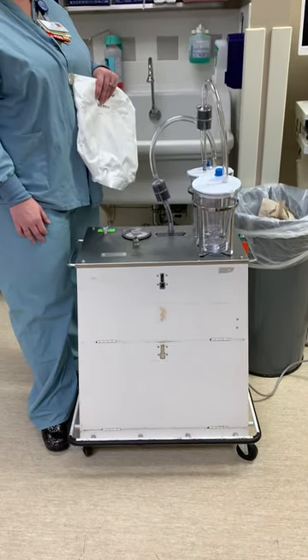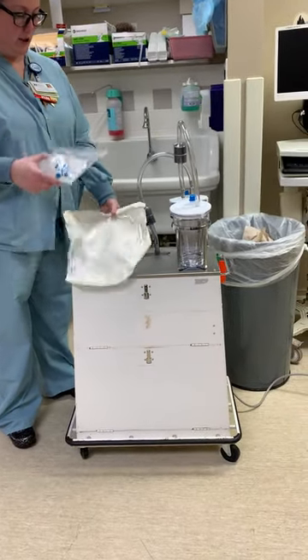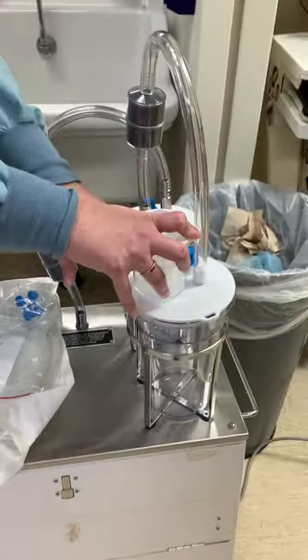We're going to do a demo on how to use the DNC suction machine. First, you need to put your filter up. It goes here where it says 'patient,' so you just put it in there.